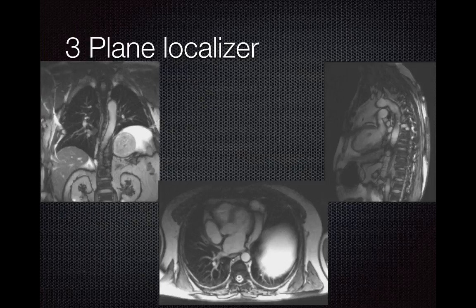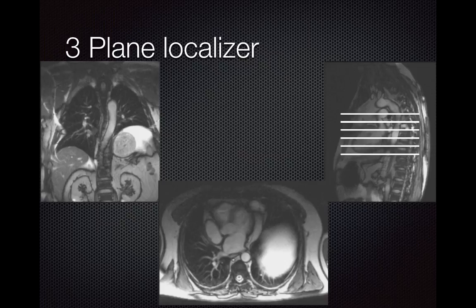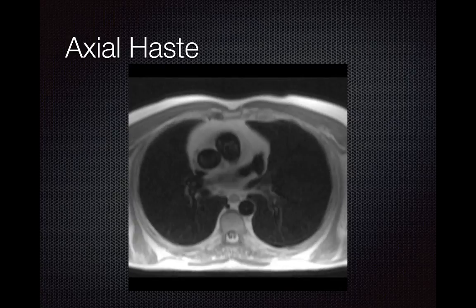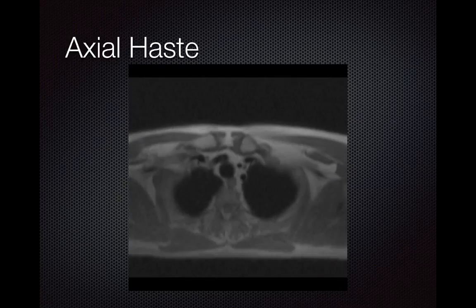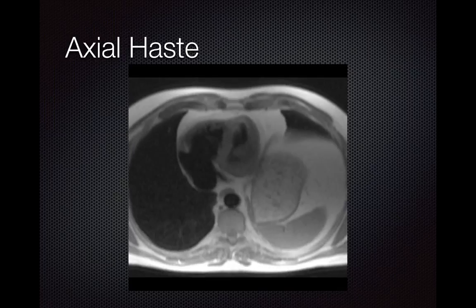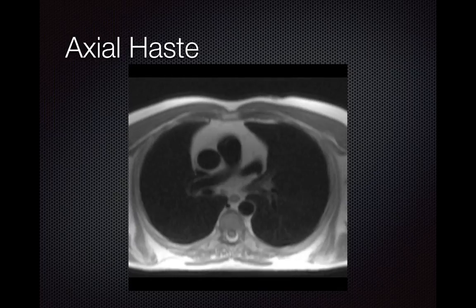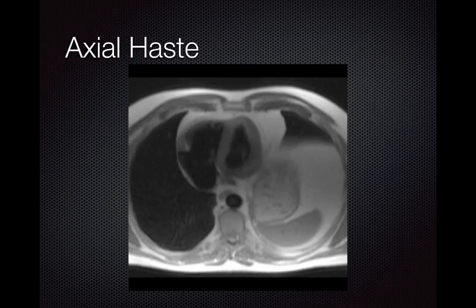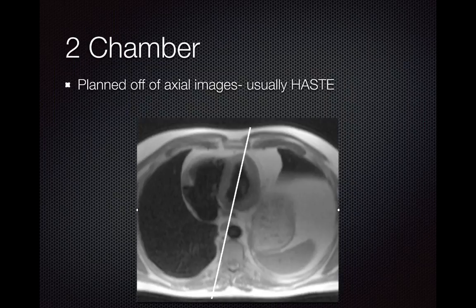In general, we're always going to start with a three-plane localizer, giving us our axial, coronal, and sagittal images. From that, we acquire another stack of axial images, generally from above the aortic arch to below the level of the heart. Here's our axial stack of HASTE images — a black blood set — used to look for gross abnormalities and to set up our two-chamber view.